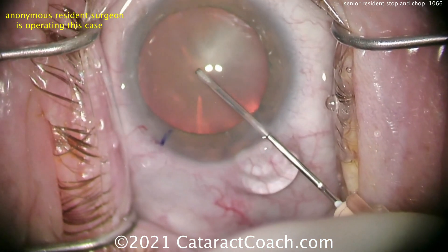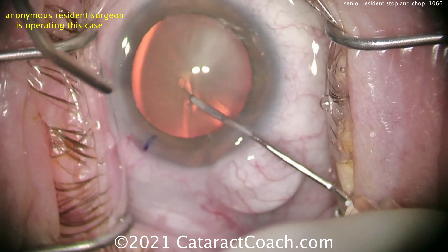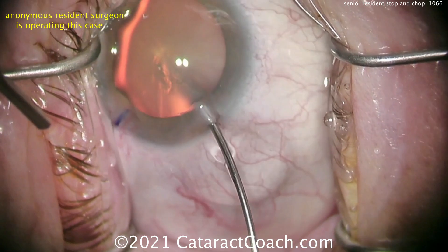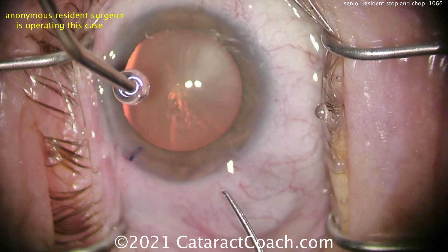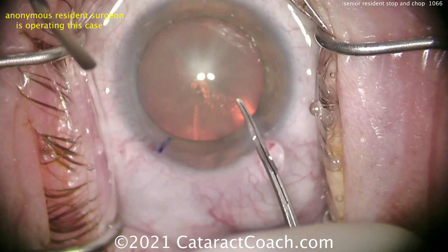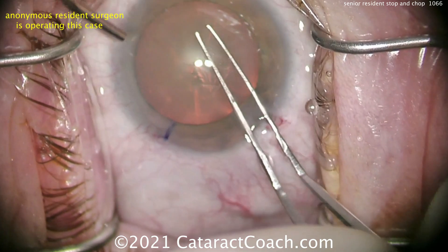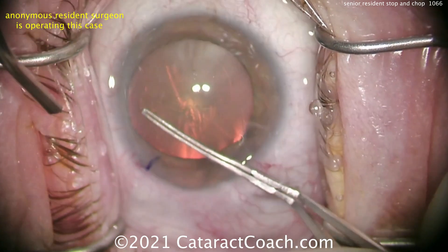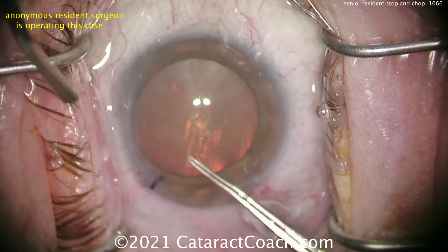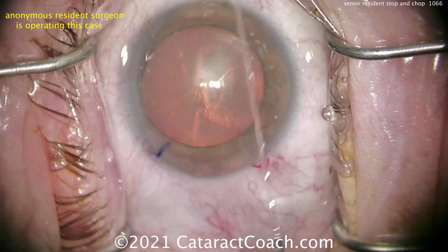Now let's see the rhexis. That's a little tough because the patient still has quite a bit of movement here. Starting off with the cystitome and getting that flap turned over — that looks pretty good, with only a little viscoelastic egressing from the incision, which is a good sign. The attending assistant is squirting the cornea. Now here comes the rhexis. Notice how the forceps pivot within the incision and are not being pushed up against the walls. Very nice job on the rhexis. That's a beautiful rhexis.